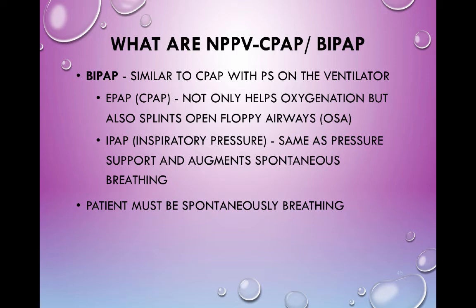So EPAP is the CPAP, so we can call it CPAP, EPAP, PEEP. Let's see, what other acronyms do we have here? There's a whole bunch of them. So then the inspiratory pressure, we have our BiPAP, our IPAP, our inspiratory pressure, many other names.